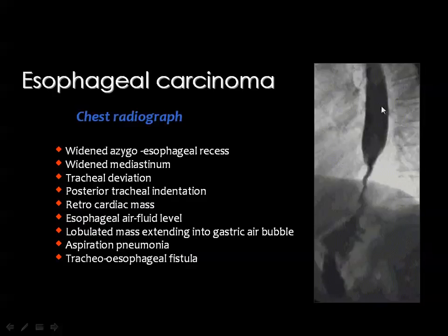But if you look carefully, you can see that the esophagus proximal to the stricture is not markedly dilated, it's moderately dilated. And then you should have an endoscopy to exclude the possibility of carcinoma, which may sometimes be misdiagnosed as achalasia from radiography, but the clue is the degree of dilatation of the esophagus proximal to the stricture, which is usually mild in cases of carcinoma.